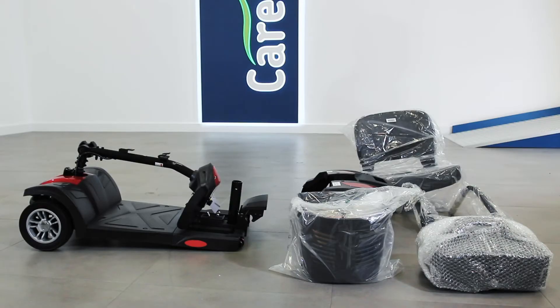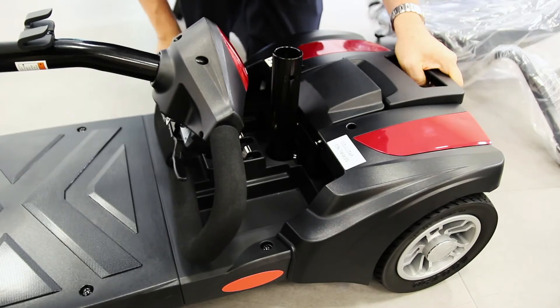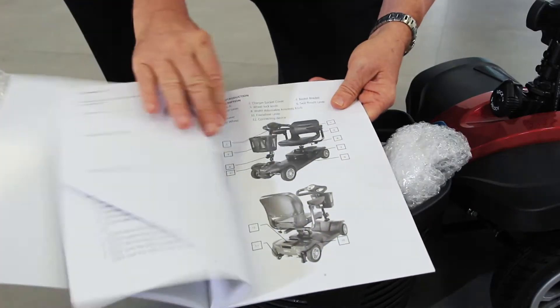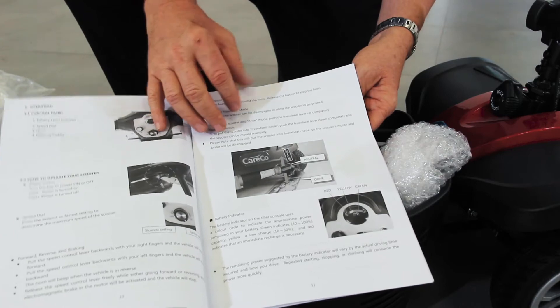Now you can start assembling the scooter. First reconnect the front and rear section and then raise the tiller. Packaged in the front basket you'll find an instruction manual. Please keep hold of this as it contains useful information on how to use and maintain your scooter.